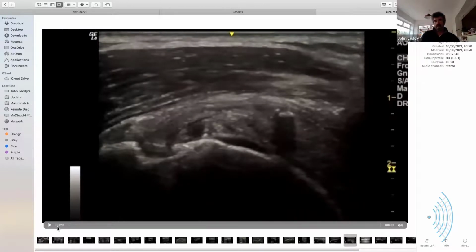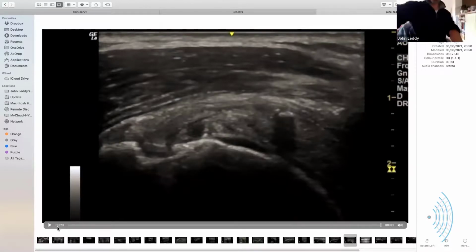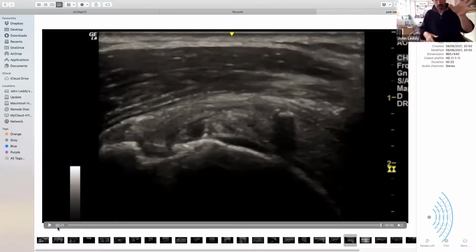I just put it in that karate punch position like this. Hand a little bit further down. In my old patients, I literally just have their arm resting on the back of the chair, with the palm facing forward like that. That's enough. And if they're sore, they just lean back against the chair, and then it stops being sore. Most shoulders you can get all the way around supraspinatus and infraspinatus just by that. I then move the arm this way and look at the back.